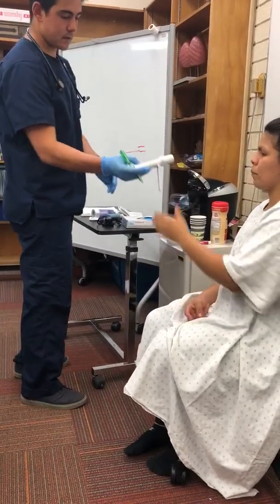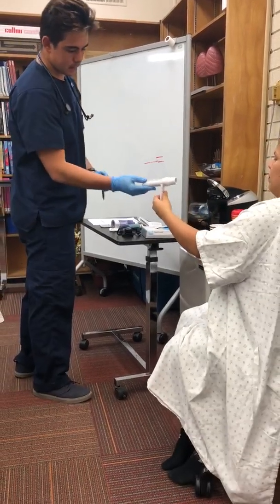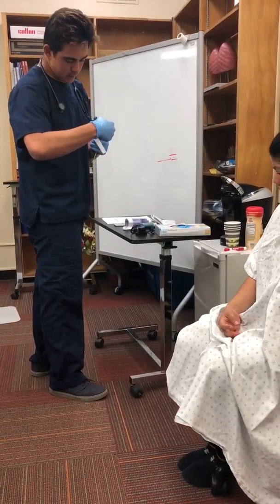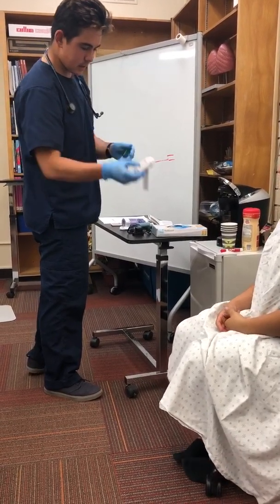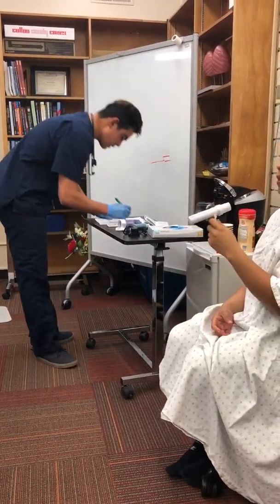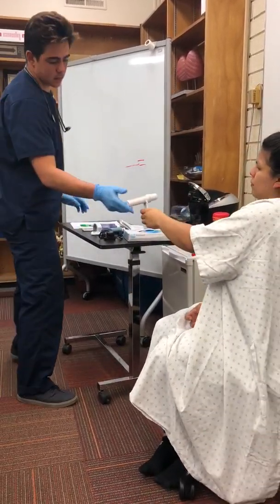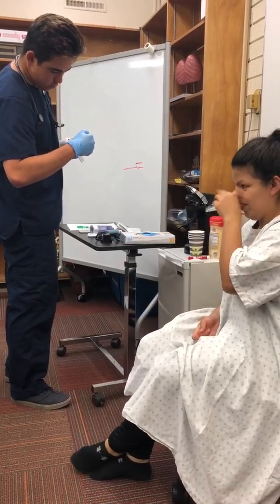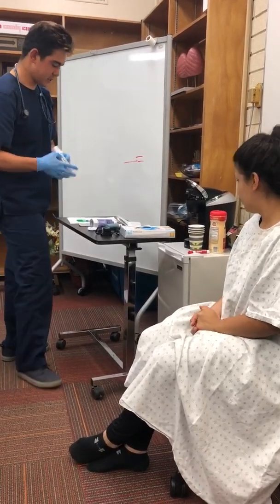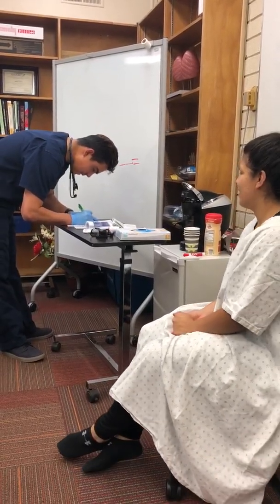Reset that. We are at 430. We're at 420 for that. Great patient effort, by the way. Good job. How are you feeling right now? I feel good. Okay.